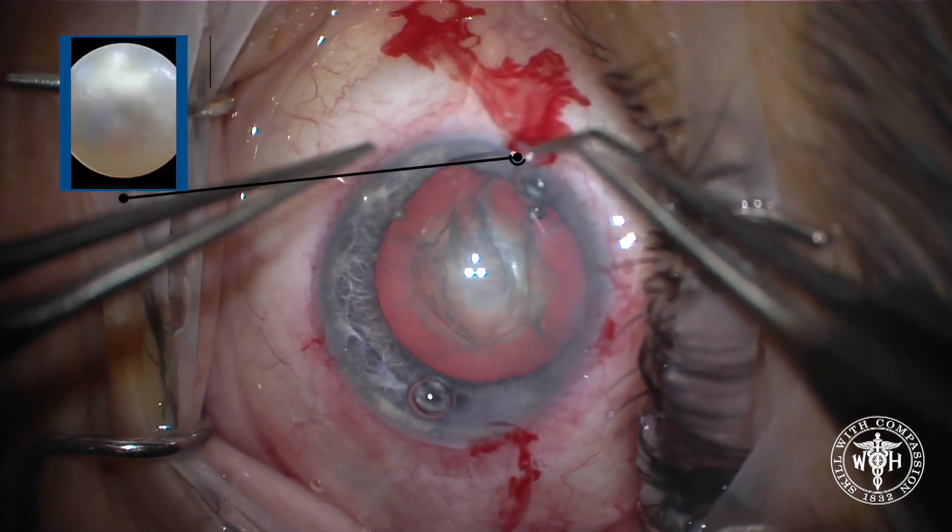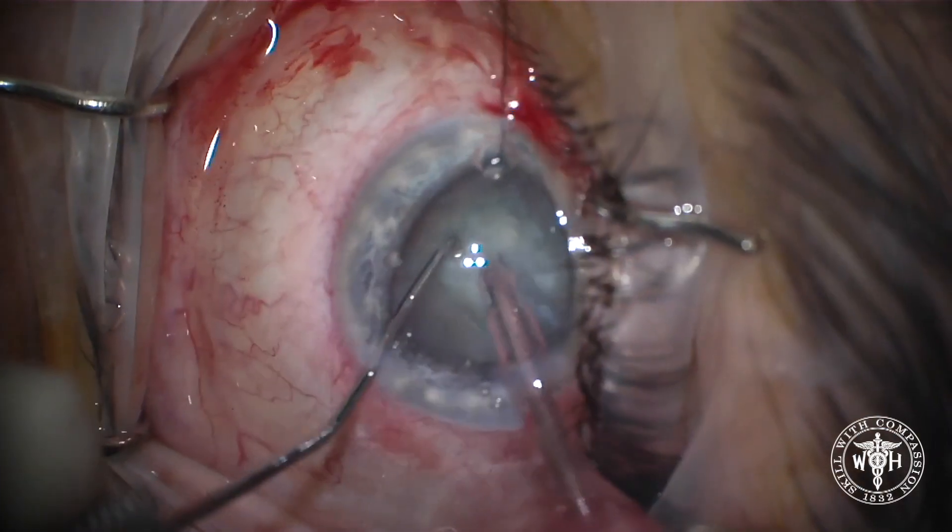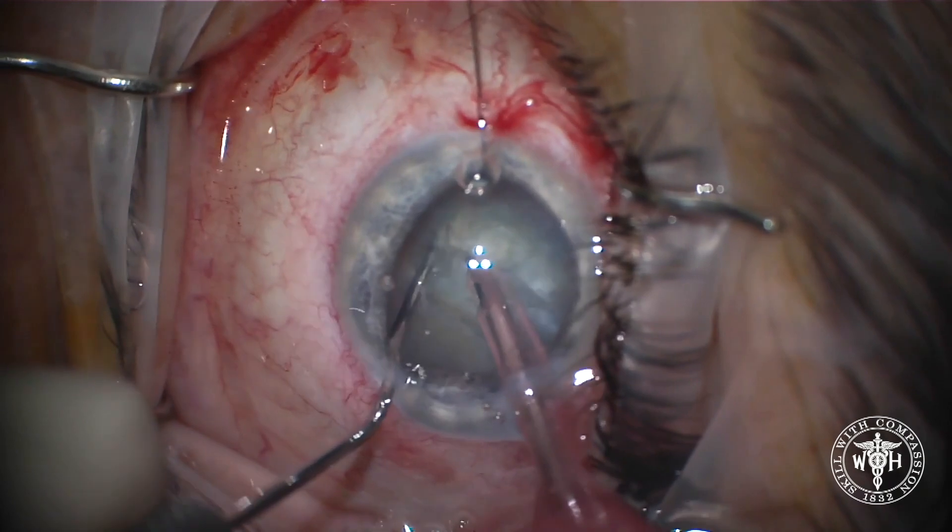The trick here to stop this is just to simply place a single flexible iris retractor, hooking it under the iris to elevate the iris, and now we'll go back and start surgery again.